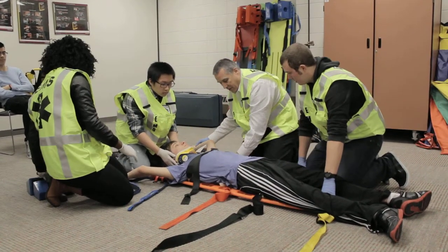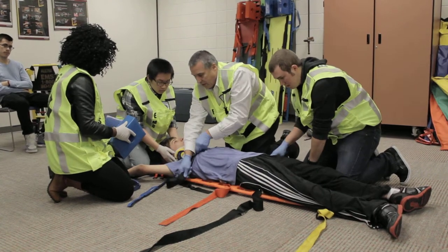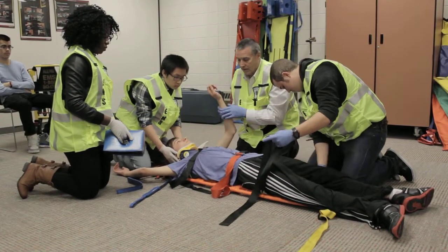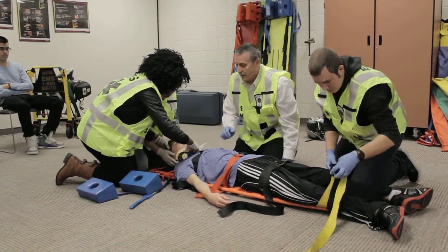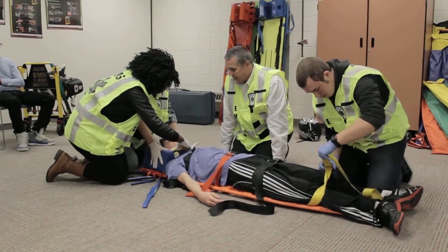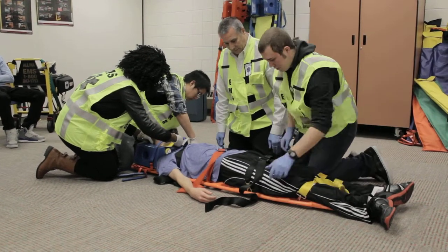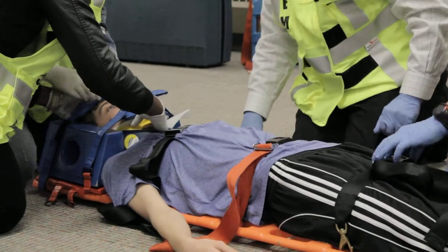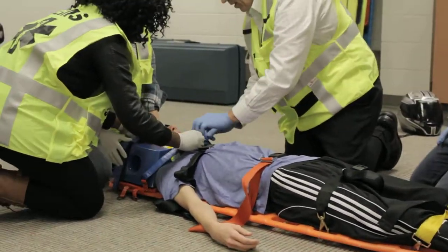We're going to go ahead and secure his chest first, and his torso. You guys can go ahead and secure the head. You're going to hold C-spine on the head. All right, you got it? Yeah. We'll just check the straps and make sure they're tight. Okay, we have him secured onto the board.